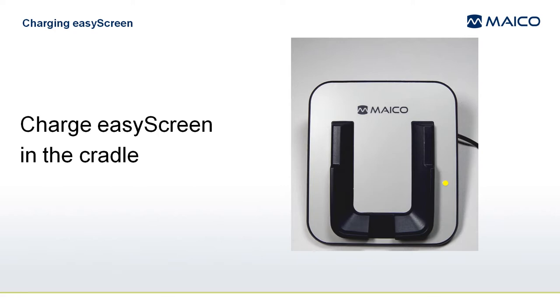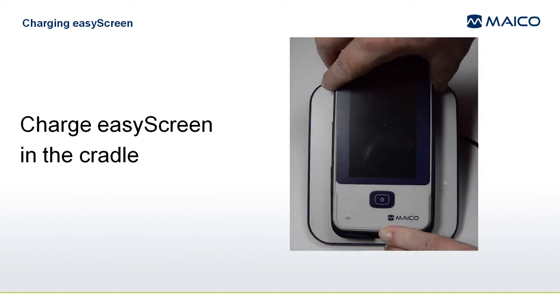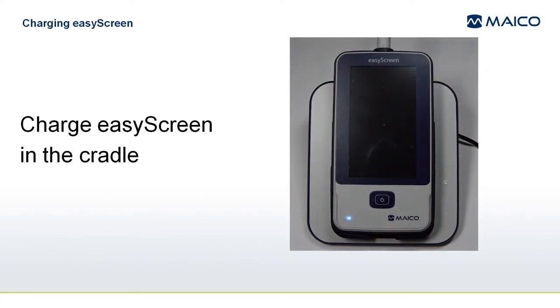Plug the power supply into the wall outlet. Note that an LED on the right side of the cradle will light when it is plugged in. Place the EasyScreen into the cradle so that it is set securely inside the raised guides. When the EasyScreen is charging, you will see a lighted LED in the bottom left corner when the device is switched off.